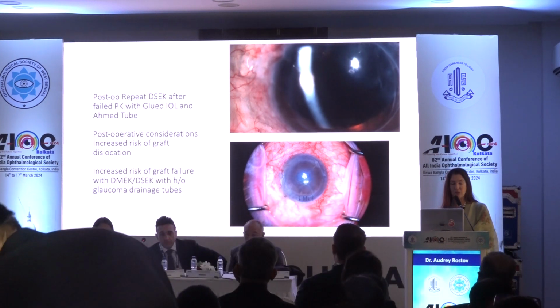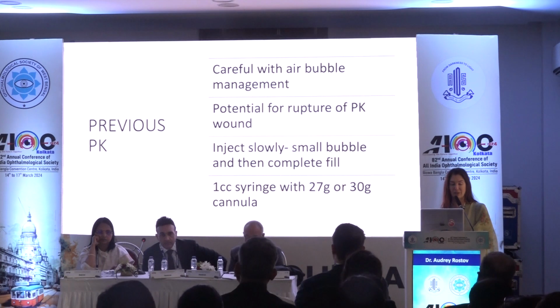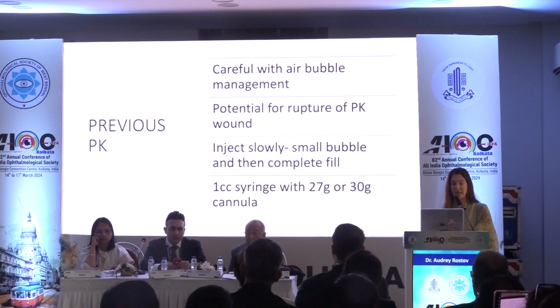There is an increased risk of graft failure with DMEK or DSEK with a history of glaucoma drainage devices, and so to keep that in mind, I know that Dr. Aldalvi is going to be speaking about that. When you have a previous PK, you need to be careful with your air bubble management because there is potential for rupture of the PK wound.